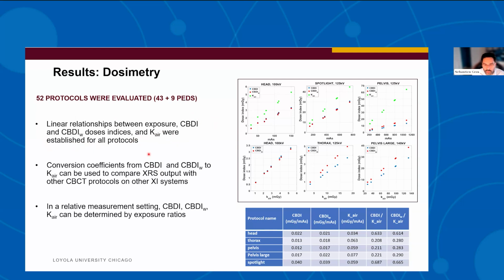And that was very useful because it was difficult for me to access the CTDI phantom, and there was also the time constraint to perform those CTDI measurements. You just stick the Farmer chamber at isocenter, you do your measurement, and then you're done. So this is also useful for the comparison of imaging dose between our 4 different LINACs, or with an external institution equipped with different imaging systems, with or without calibration or CTDI, to compare our doses. So these are the coefficients that we established from that.